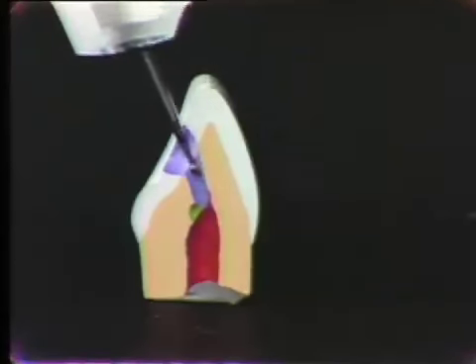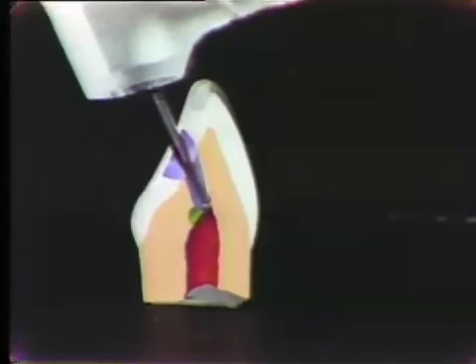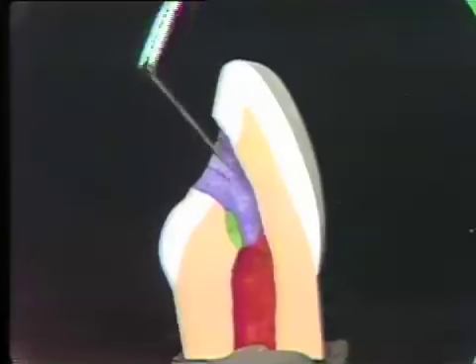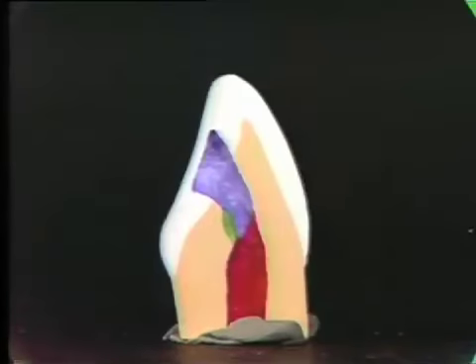Now you keep on doing this in and out, feeling for the roof, making sure that you keep away from the walls so you don't gouge the tooth, until you feel the burr pass from the pulp chamber to the surface without any kind of bump or click. When you feel this, you turn the handpiece off, you get your Endodontic Explorer, and feel the walls of your cavity preparation. Make sure that you've completely removed the roof of the pulp chamber and that you haven't gouged the walls. We've completely removed the roof.